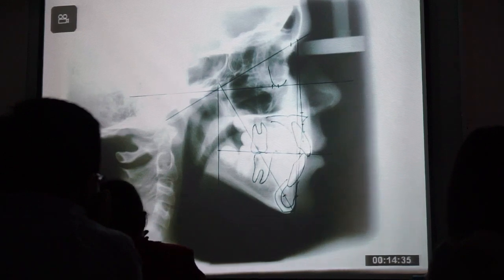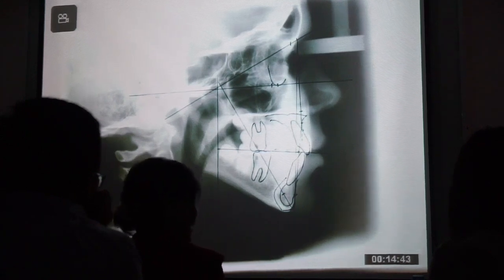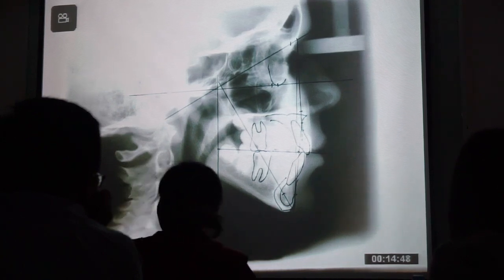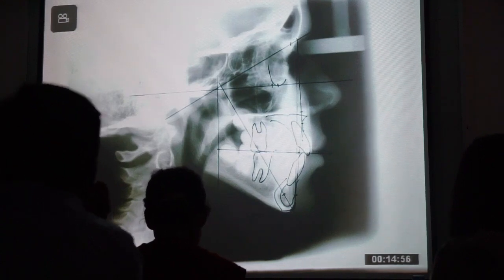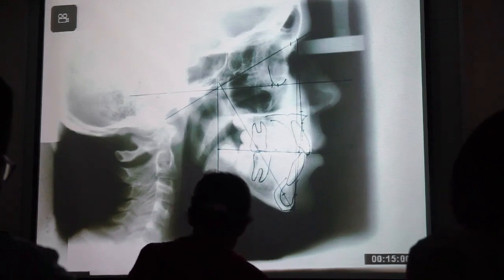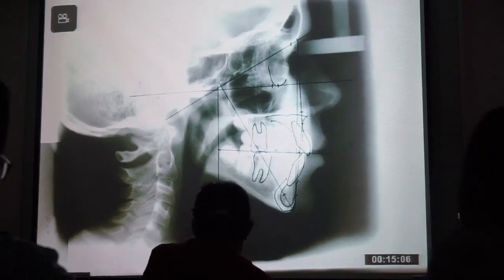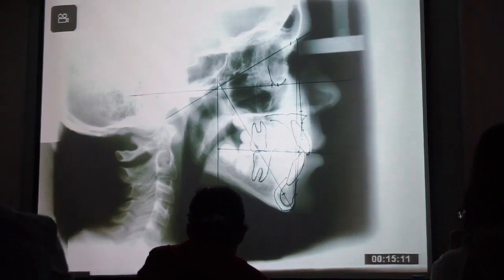I want you to practice this with yourself. It's easy, it's fast. This technique, cái kỹ thuật này, is very, very fast. And now we do together. I ask for a case from them. If they have a case with two X-rays, one in let's say 7-year-old and the other one 15, thì chúng ta có thể ngồi làm cái video tiên đoán, rồi chúng ta coi thì thực sự nó xảy ra như thế nào.